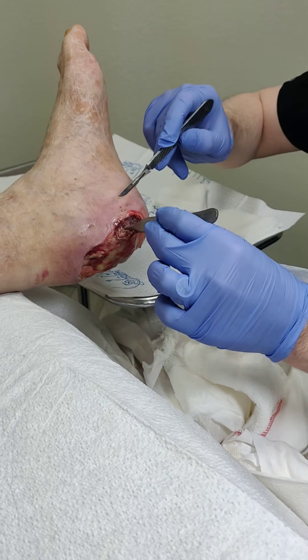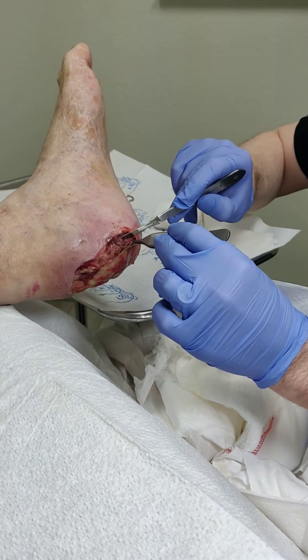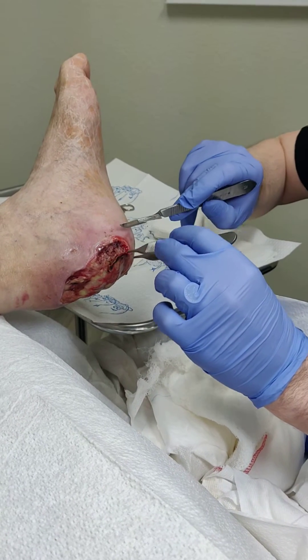We're doing that with a product called EpiCord, which is a skin substitute produced from umbilical cord donated after childbirth. And it really helps to speed the process along.